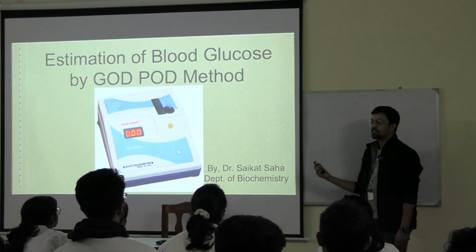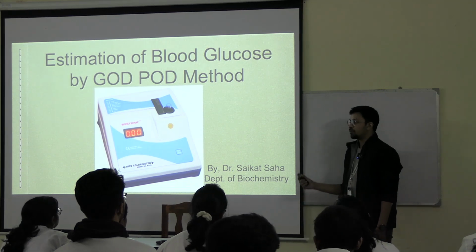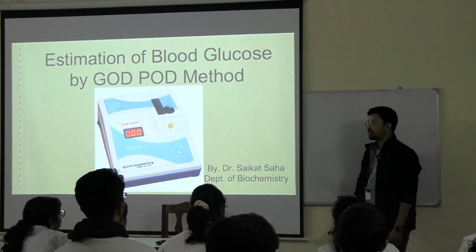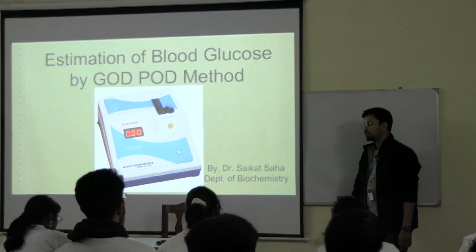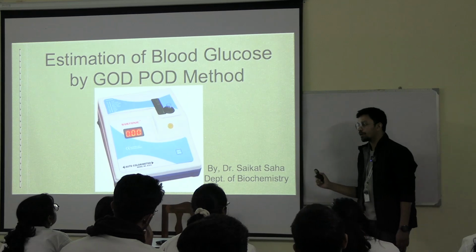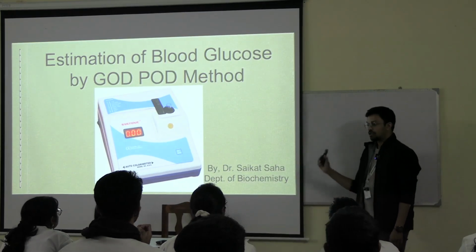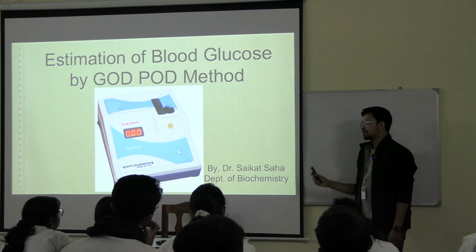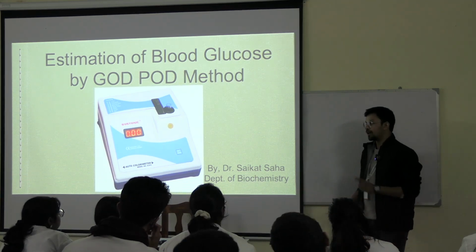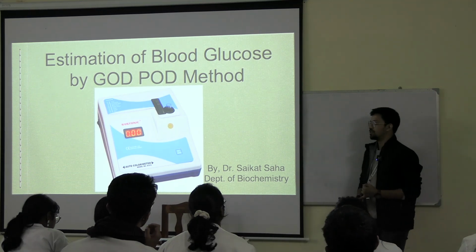First is glucose estimation. Another one will be protein estimation. And mind my words, both these tests will be there in your upcoming formative assessment as well as in your internal assessment, and each of the tests holds a chunk of marks. So you have to perform the test perfectly. Theoretically this is very easy, nothing much to say. It depends upon one law that has already been covered with you, that is the Beer-Lambert law, right?